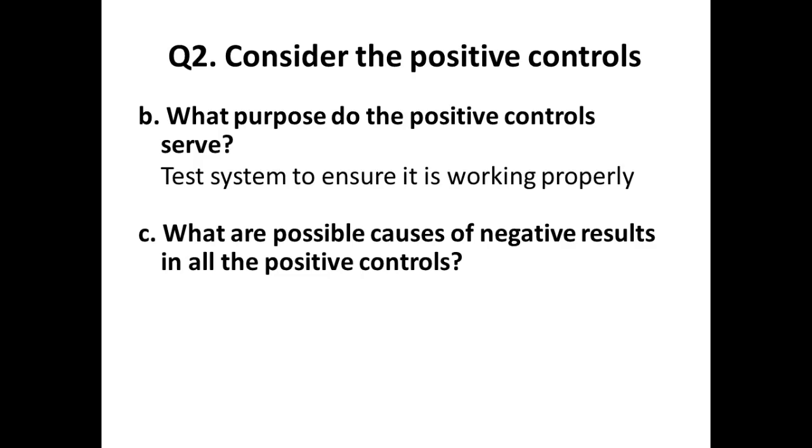So if it's negative, you always still have 1 line, your positive control. If you don't have that 1 line, the test is going to tell you error. Redo it. It didn't come out as expected for its positive control, so you can't trust your sample. Okay? So our controls have got to come out as expected, right?